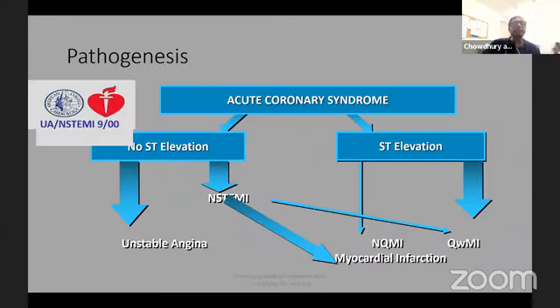So a transmural MI will give you wall motion abnormality, will show you transmural ST segment elevation, and later on will evolve into a Q wave MI. But we don't wait for Q. So when you are dealing with someone in the beginning, whether there is a Q or not is not going to be the deciding factor about what you do with this patient. However, the presence of Q tells you something. So pay attention to that.